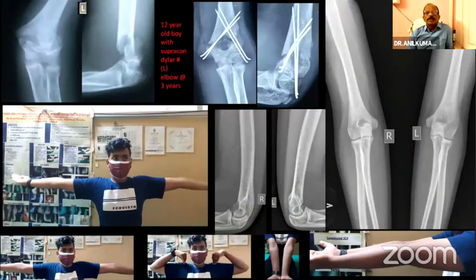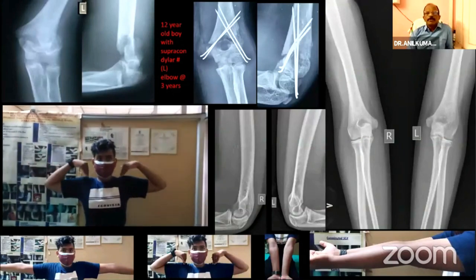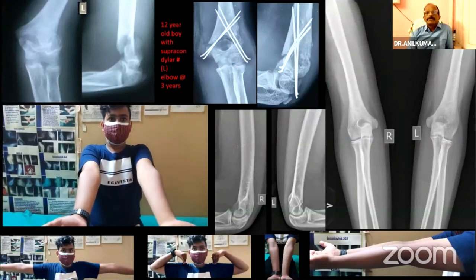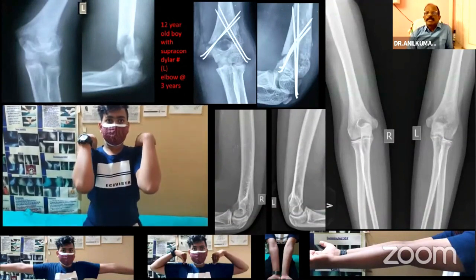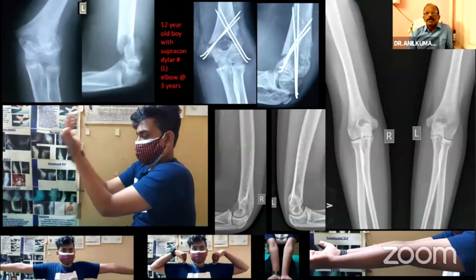This is a 12-year-old boy with a supracondylar fracture, left elbow, 3 years after the video was taken, and the preoperative X-ray, postoperative X-ray, as well as the X-rays of both elbows are shown for result comparison.